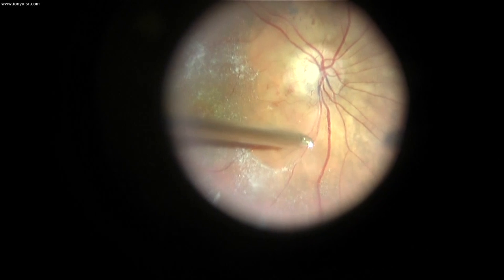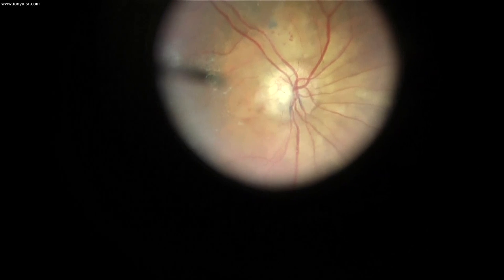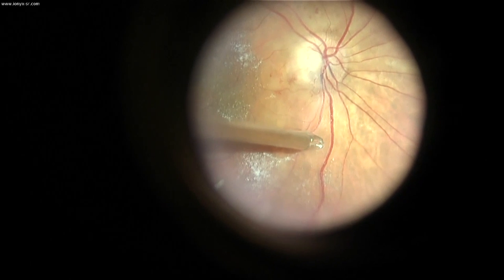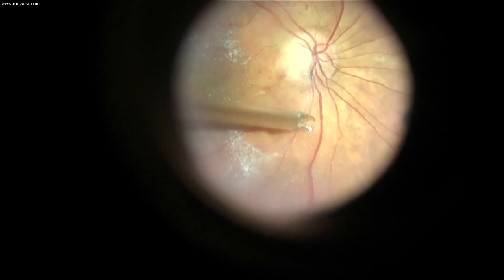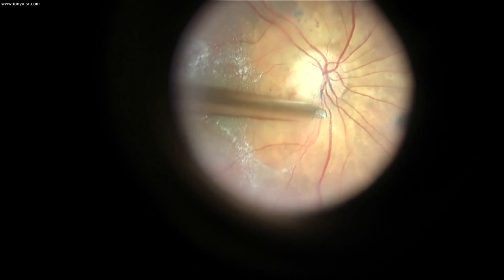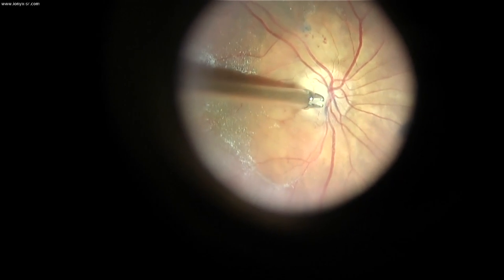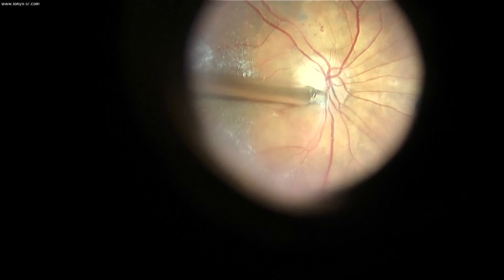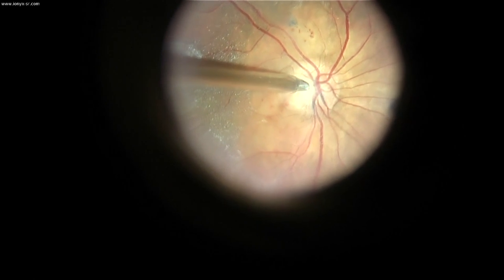So what I'm doing, I am peeling the ILM in the peripapillary zone, as you suggested. The only thing is that when I reach the border of the papilla, of course the peeling stops. And I cannot really see an epipapillary tissue to peel as it actually appears on the OCT. So I wonder how to insist, how much to insist. There is some staining here, which is probably the ILM around the vessels.